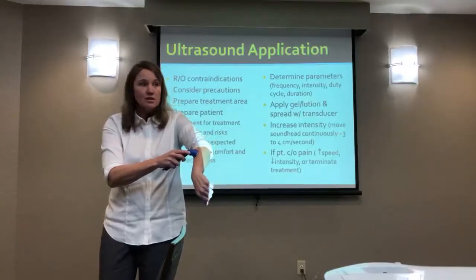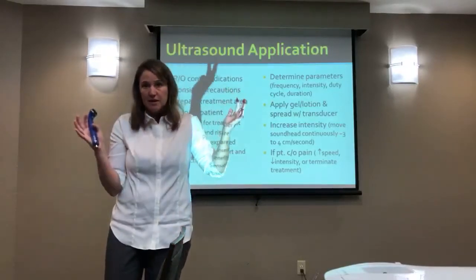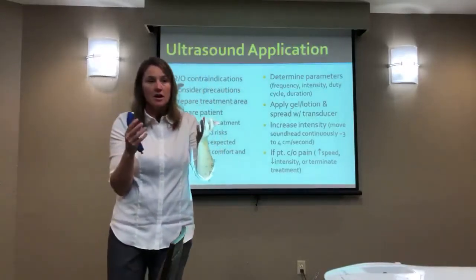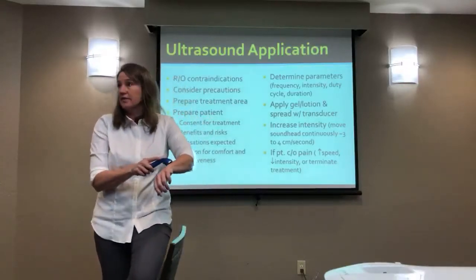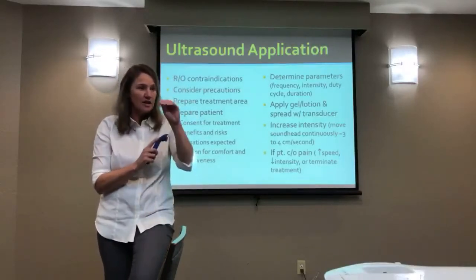Most of our rooms in our facilities have second-hand clocks in every room, because I'm constantly wanting a second hand in order to take pulses and things like that. So I would be looking at the clock and gauging my timing, especially if I'm talking.